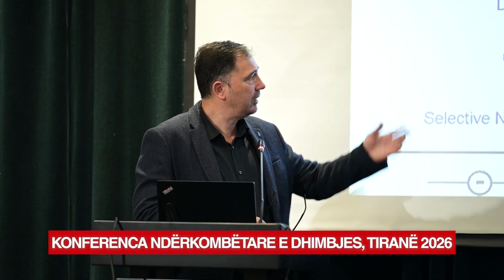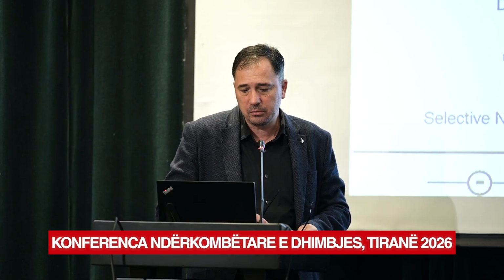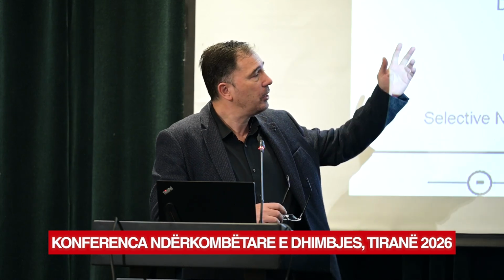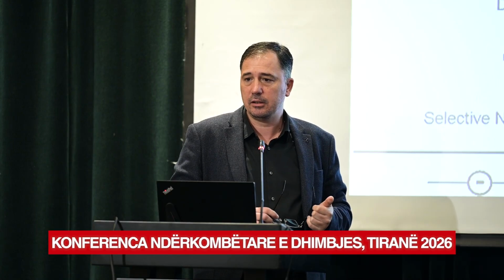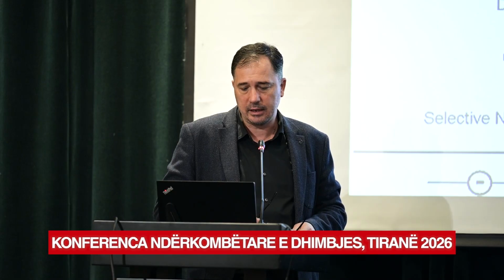So this is a schema that we can find in the literature about the causes of chronic back pain. So there are 3 steps when we inject the mixture of corticoid and anesthetic.